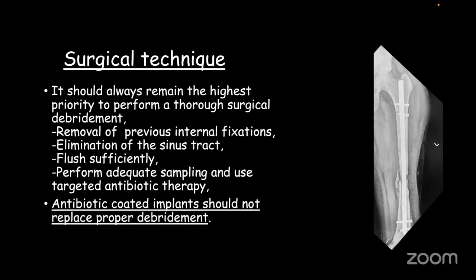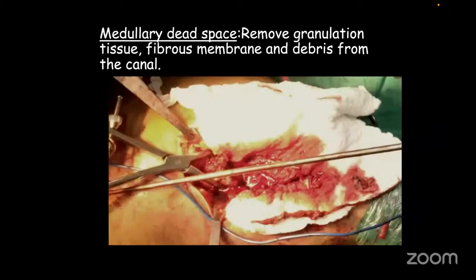So antibiotic coated implant should not replace a proper debridement. It should not be a concept that whatever may be the infection, I just put an antibiotic rod and it is going to do a magic. It is going to clear the infection and it will make the cavity sterile. It is never going to be that way.